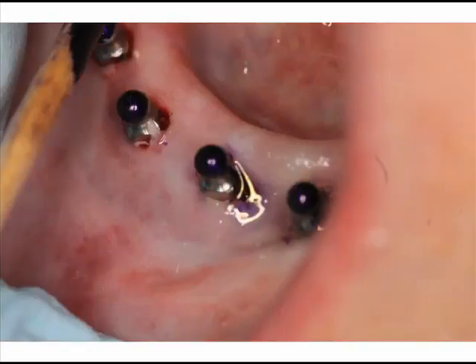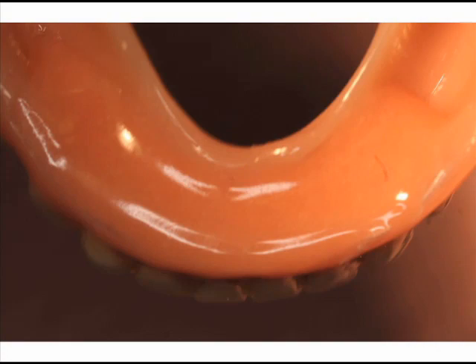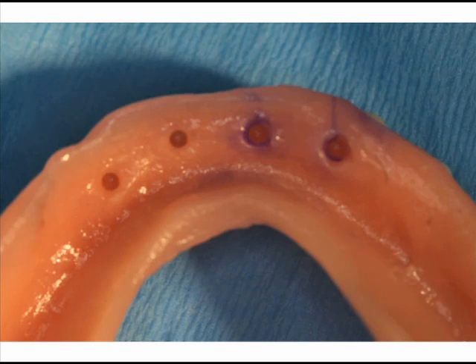Next, the patient's existing mandibular complete denture was relieved extensively at chairside, and a soft reline material, such as Kosoft, was placed to stabilize the denture. You can see in figure 52, I use a little indelible marker to actually mark the inside of the denture and relieve that area extensively. Figure 55 shows the use of the Kosoft material. Figure 56 shows the placement of the implants in the soft reline material.